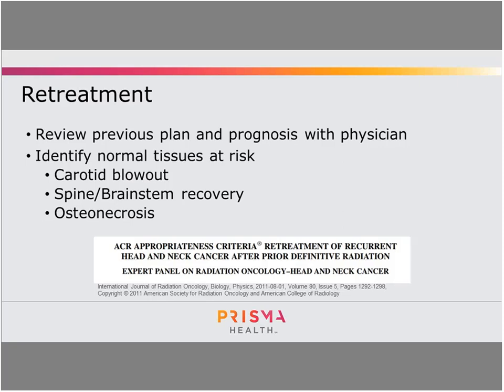So I'd say that's one of the worst case scenarios you get when you're planning head and necks, is when you have to retreat. And you really have to rely a lot on your physician's expertise, and just really have open communication and go over that.